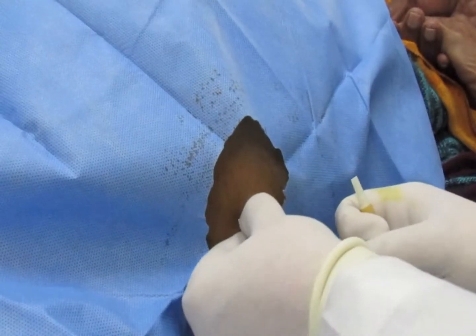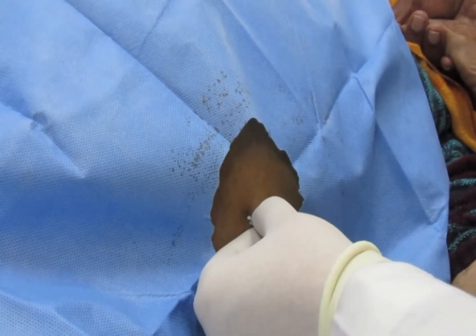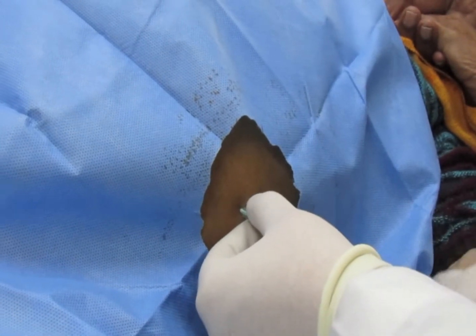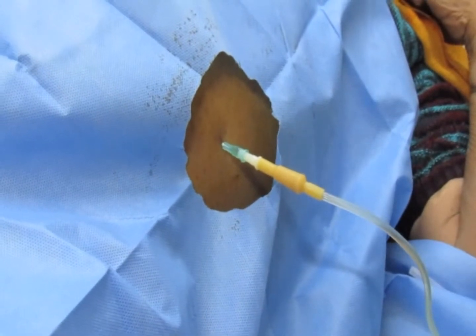The skin is pierced with the needle and the needle advanced slowly through the underlying subcutaneous tissue in 5 mm increments, while intermittently aspirating on the attached syringe. If therapeutic paracentesis is additionally required, the needle is stabilized and the syringe carefully disconnected. Non-collapsible tubing is then attached to the needle in situ and connected to a sterile collection bottle or bag.